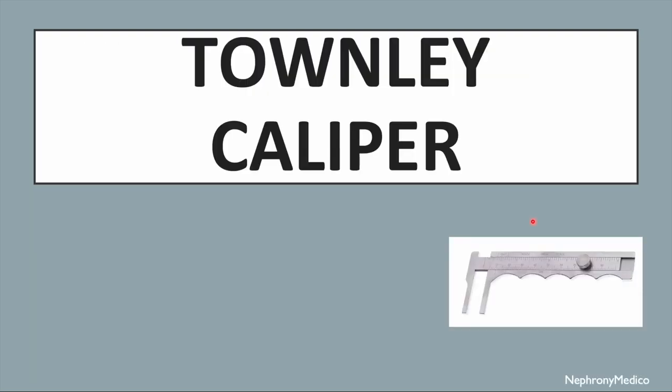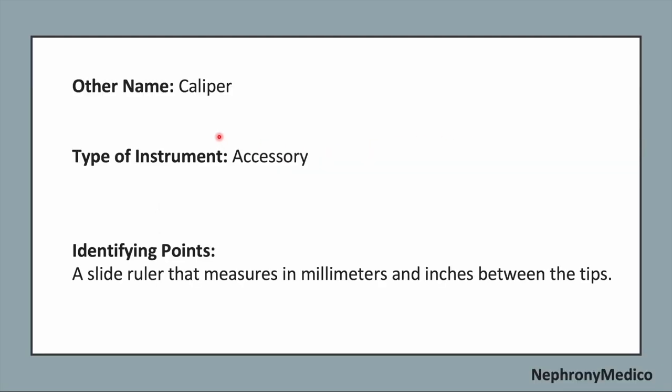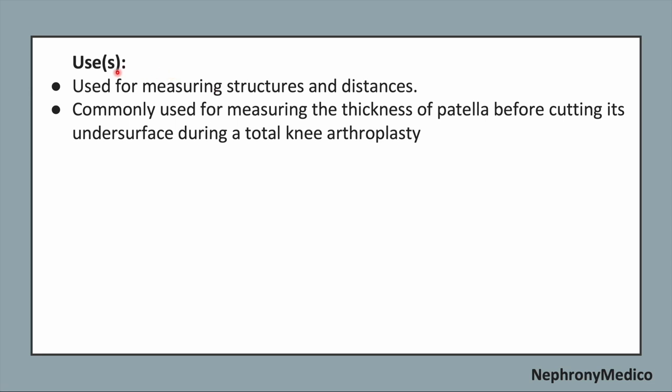Let's talk about Townley caliper. This is a picture showing Townley caliper. Now, the other name of this instrument is caliper, and it is an accessory type of instrument. Now, identifying points. A slide ruler that measures in millimeters and inches between the tips. Use. It is used for measuring structures and distances, and it is commonly used for measuring the thickness of the patella before cutting its undersurface during a total knee arthroplasty.